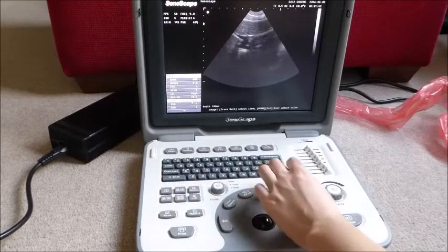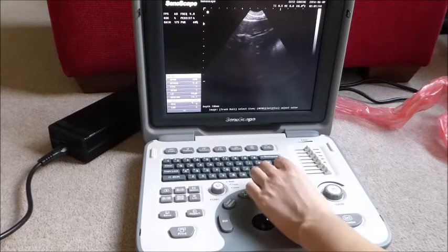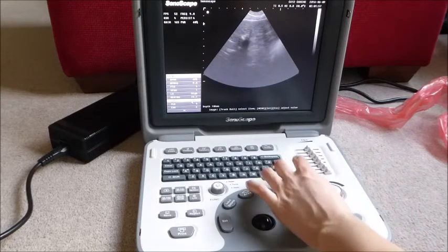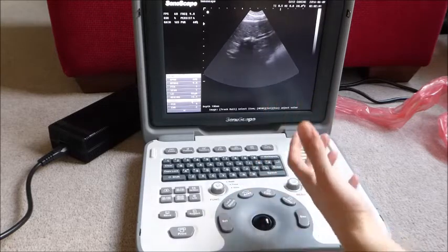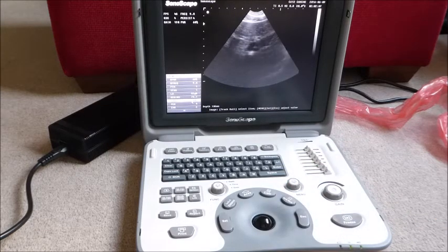Okay, so if I bring my dynamic range down, can you see how it's a really contrasted image? It's really just black and white. And if I bring it up, there's a huge range of greys there now. It's a really milky image, it's almost too much. So, I mean, there's no right or wrong number, so don't get tempted to say, oh, what number should it be on? It really depends on what you're scanning.